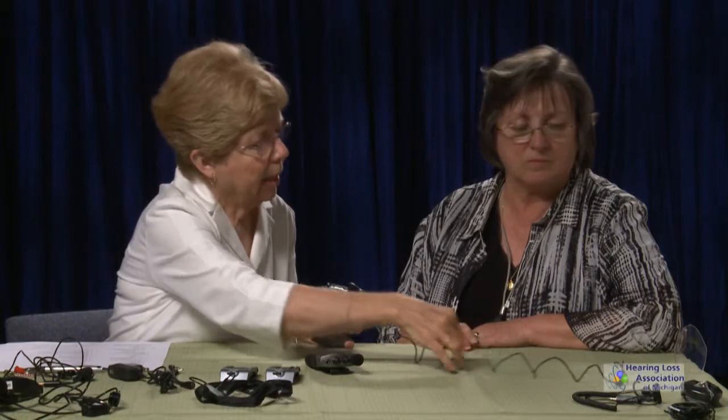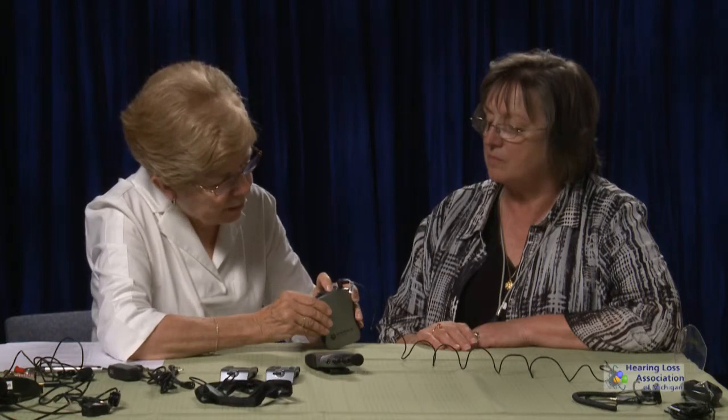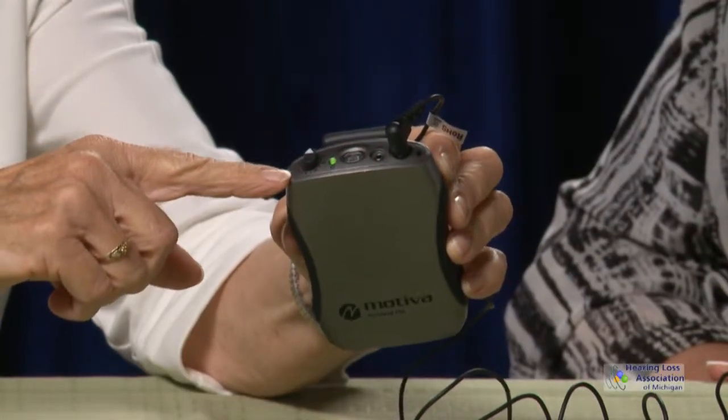What you're going to see when we look at the top is a plug for a mic, and we're usually going to use that with a lapel mic. And we have an off-on switch here. We push down on that for about 3 seconds, and a green light is going to come on to show that it's working. And then we have a channel selector. This is the channel selector.